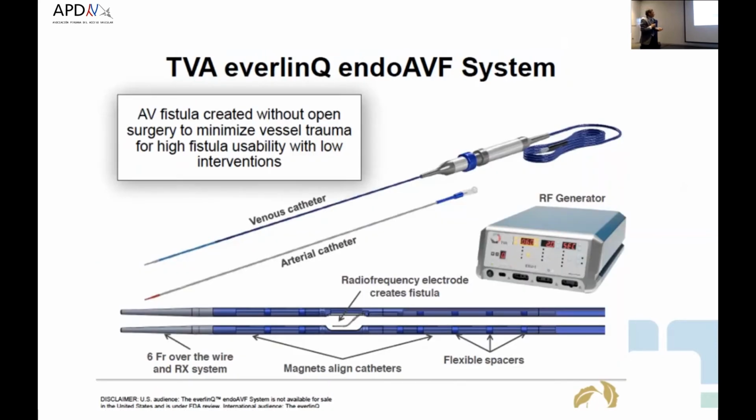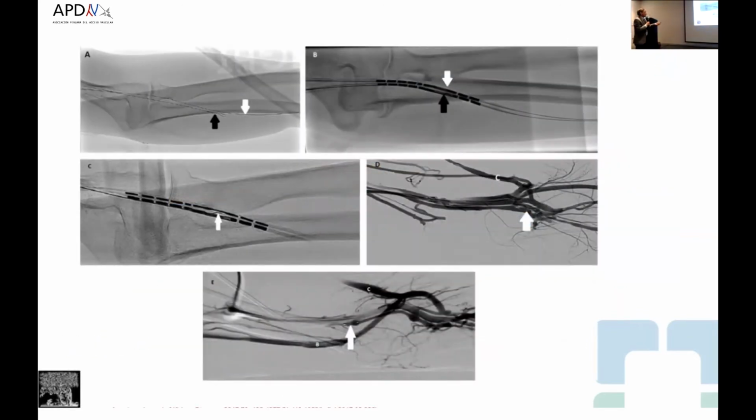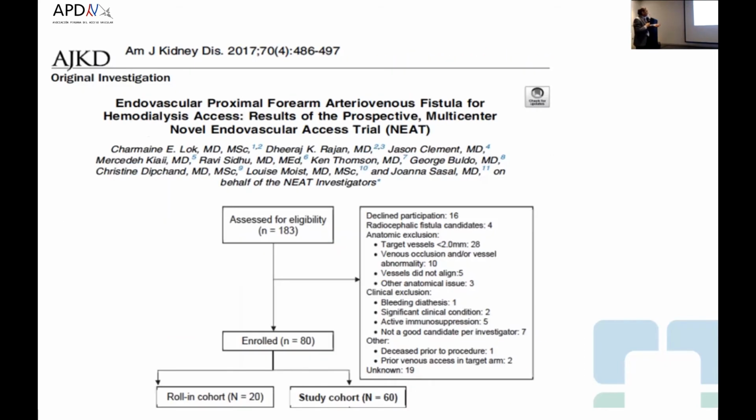This was just in case the videos didn't work. I'm going to flip through this. So this is how the fistula looks when it is created, and then because of these additional vessels, these generally are not ligated because they're deeper vessels, so one has to go in and block these with coil embolization. On histology, of course, the anastomosis that's created, the fistulous tract, is pretty clean and neat. This was done in a sheep model, so it works, but it has its negative points.